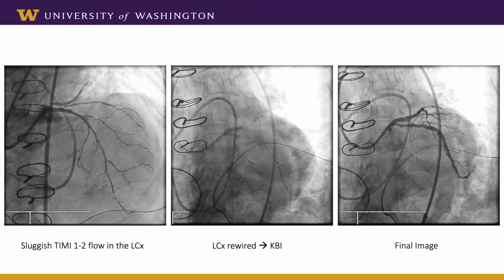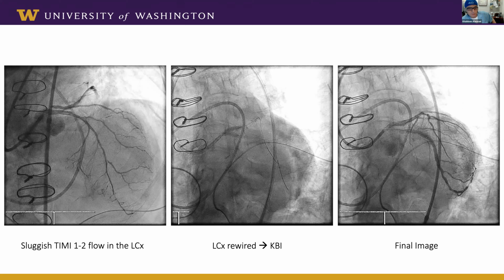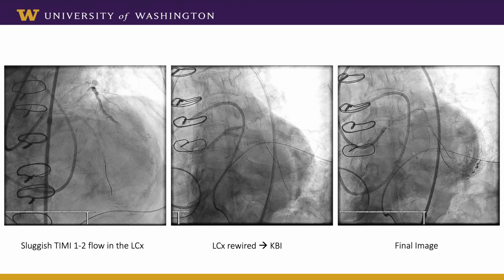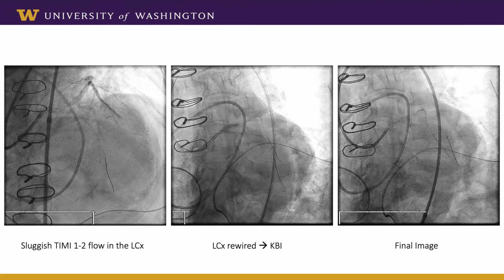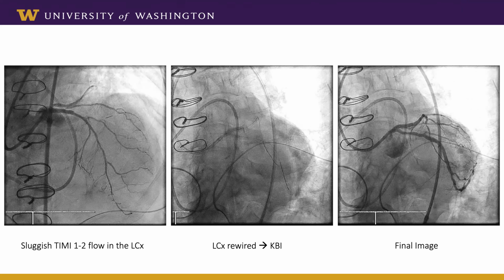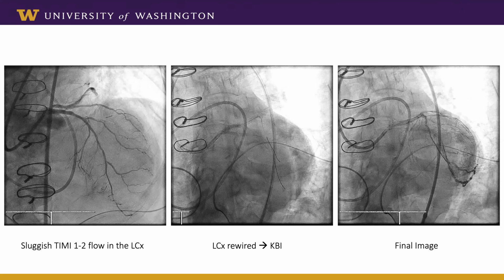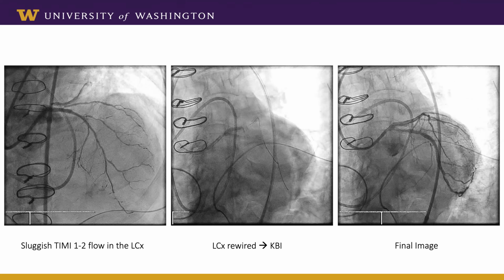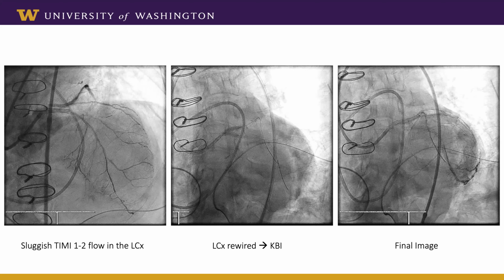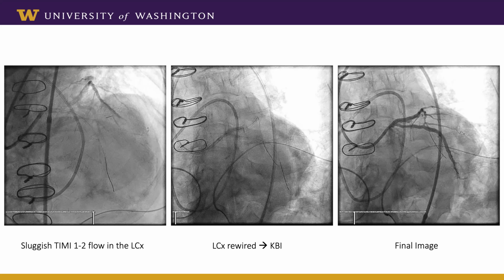In his case, we were kind of trying to wrap up, and this patient still had chest tubes. I'm going to try to get away without bifurcation stenting as much as I can. So yeah, I would agree with your strategy. In his case, I was really reluctant, given the way that flow looked and the bleeding issues, to do a late culotte and just get out of there. But when it first went down, we started calling for all the gear, figuring we were going to. So I don't know that what we did is necessarily right, but fortunately he did well, at least short term.